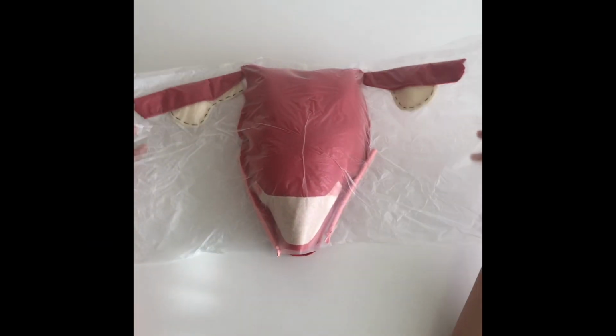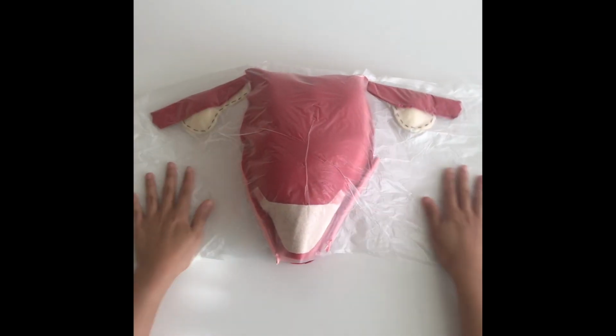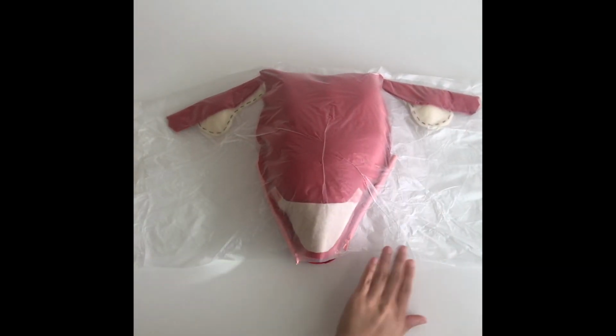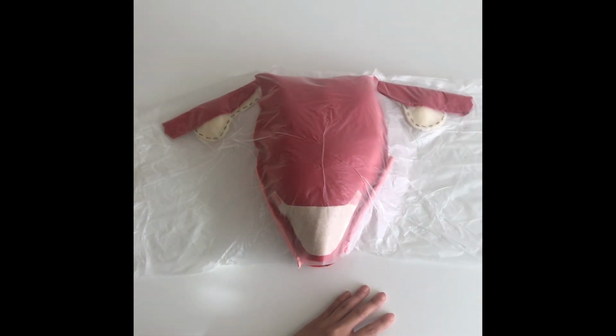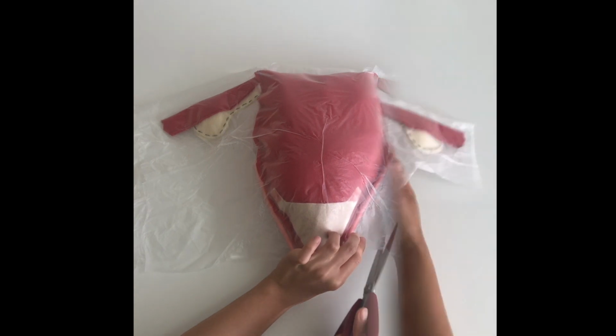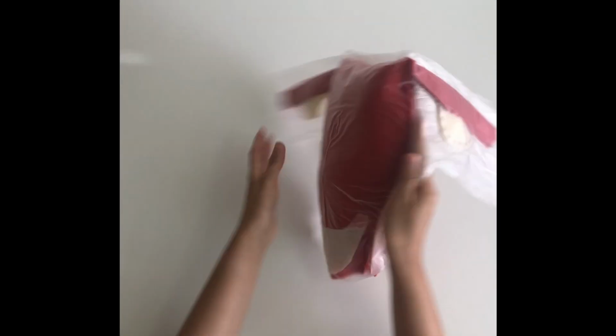Once the second sheet of food wrap has been placed on top, make sure there is a tight seal around each organ. Then you will trim the food wrap, leaving around 3 to 4 inches from the edges of the organs. And this is the completed model.